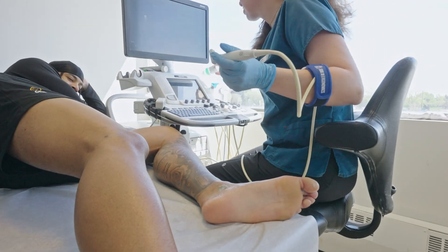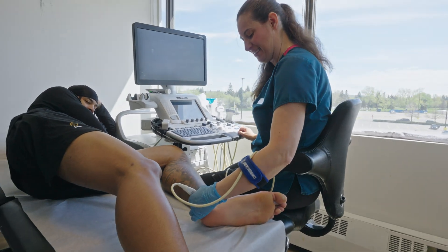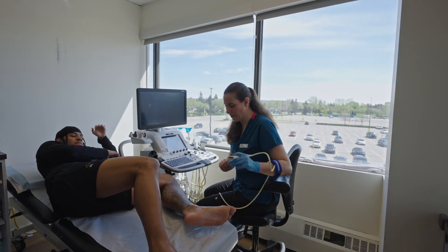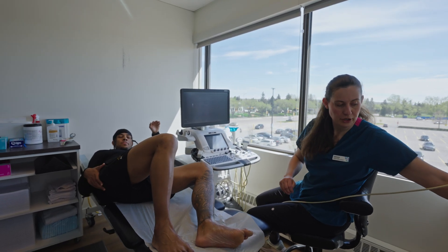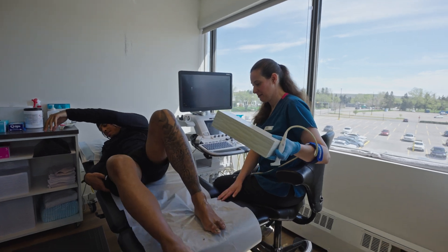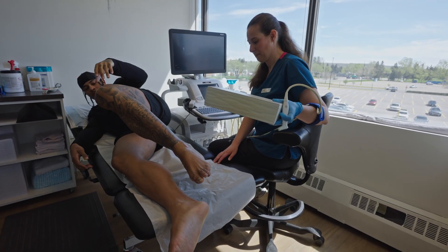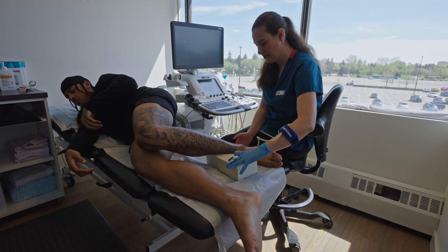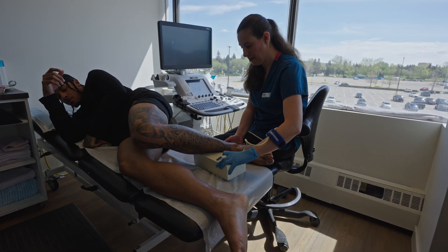I haven't been pushing too hard, have I? Last position I'm going to get you in — you're going to roll facing away from me. And I'm just going to put a cushion underneath your ankle when you're in there. You bring your foot back and just rest it down, and I'm just going to move this cushion a little bit here.